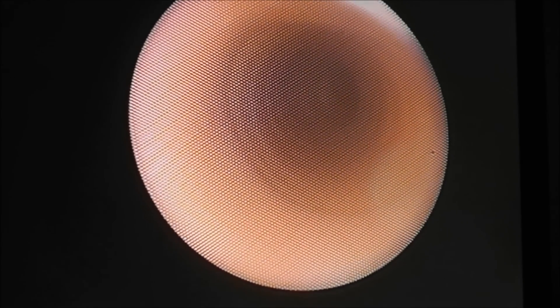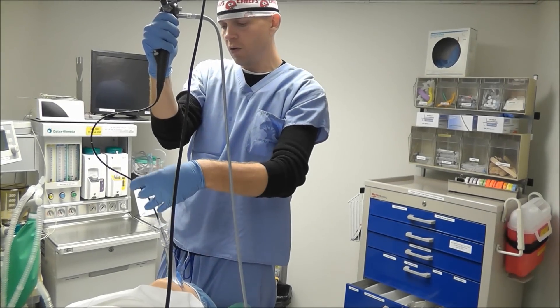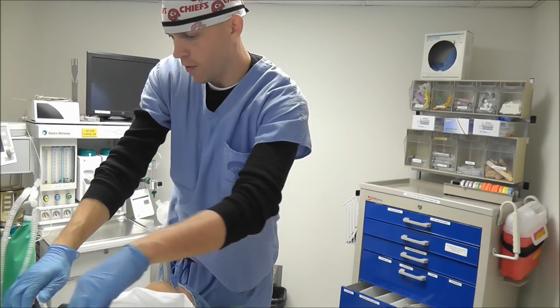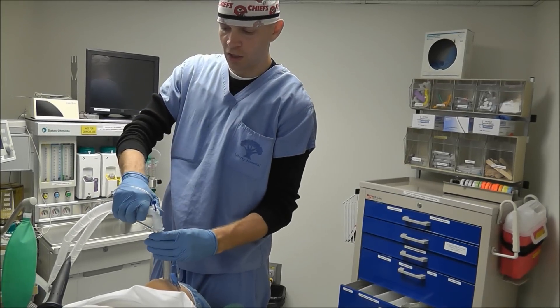Once I'm past the vocal cords, I'll just advance this endotracheal tube. So once that endotracheal tube is in there, I go ahead and pull my scope out, and then I can hook up my circuit and ventilate the patient.